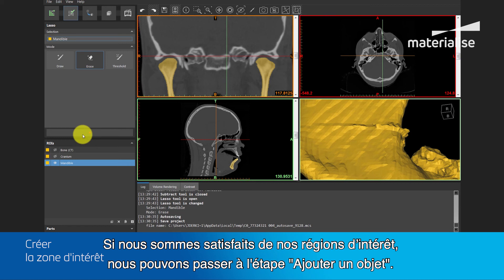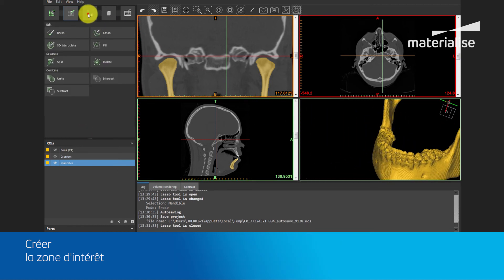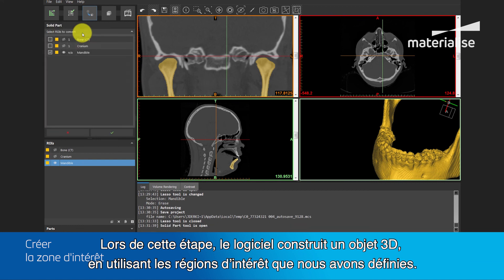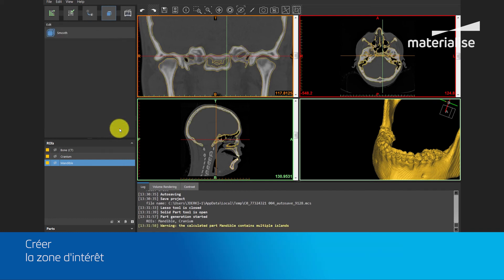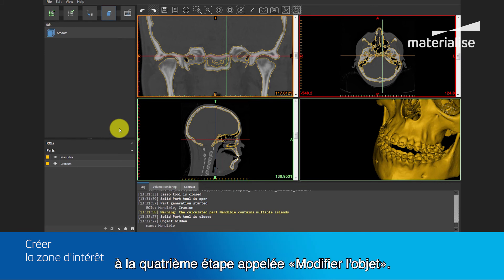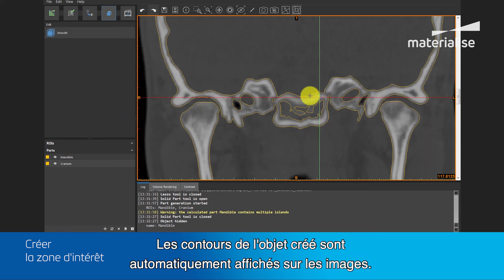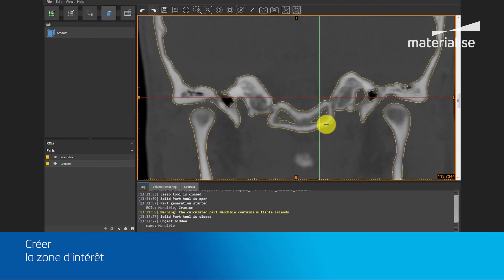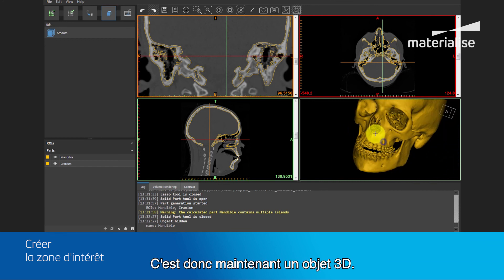If we are satisfied with our region of interest, we can continue to the Add Part step. In this step, the software constructs a 3D part using the region of interest we defined. When the parts are constructed, the software automatically goes to the fourth step, called Edit Part. The contours of the created parts are automatically shown on the image, so you can assess the accuracy of the part. This is now a 3D part.